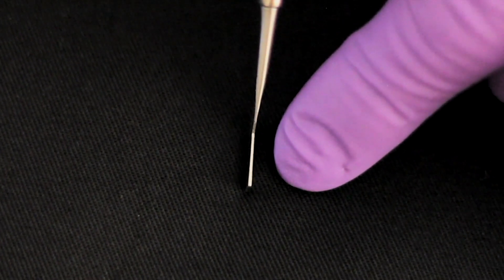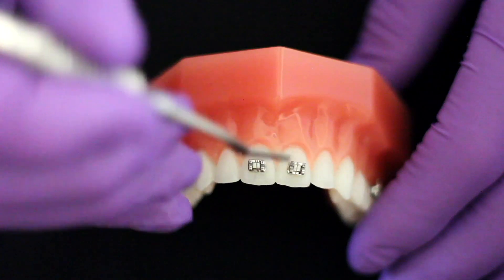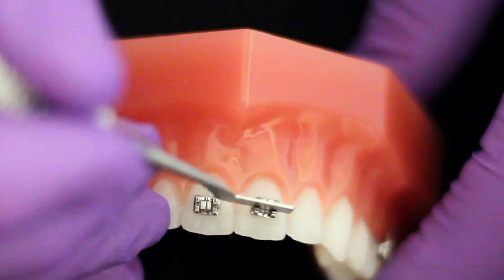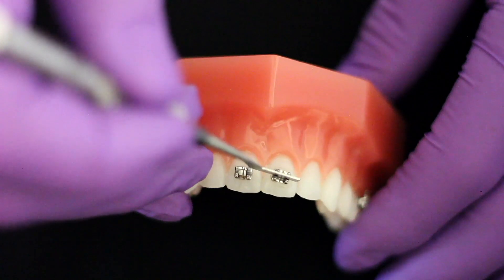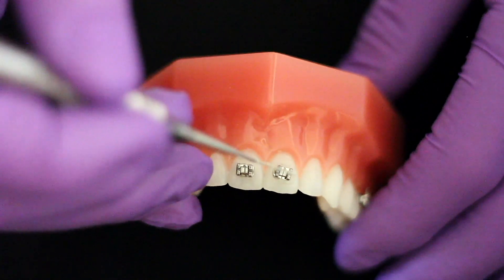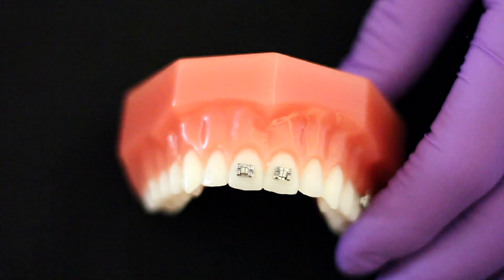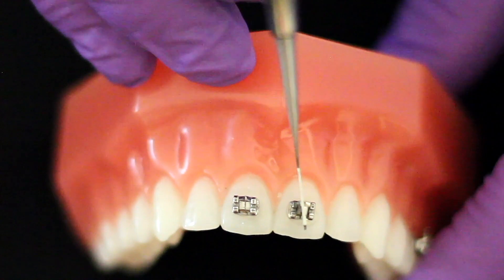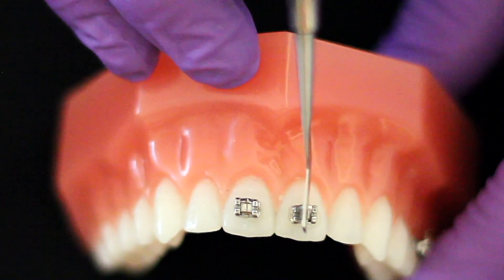It is not tapered like a lot of other instruments. The reason for the parallel sided design is that it allows the operator to maneuver the bracket into the desired position without the end binding in the slot. It can be used with either an 018 or 020 slot, and the long axis of the hockey end is very helpful in aligning the long axis of the bracket with the long axis of the tooth.